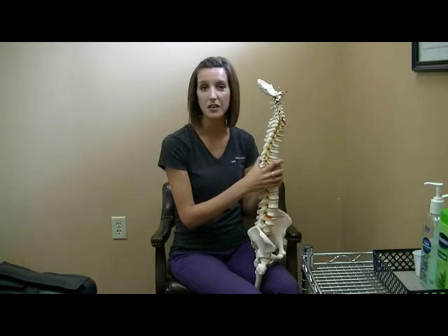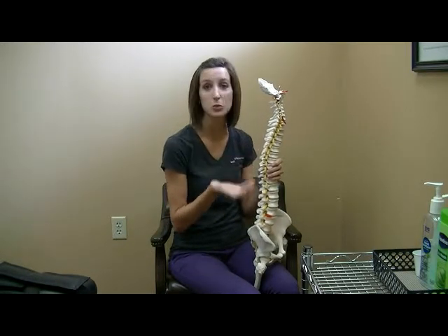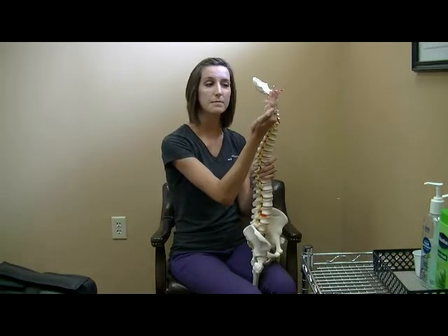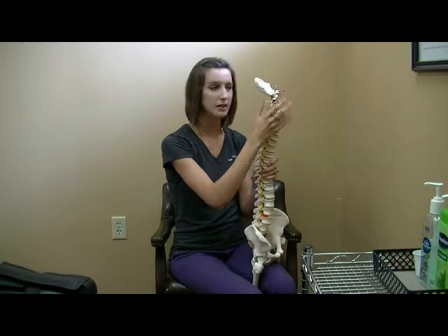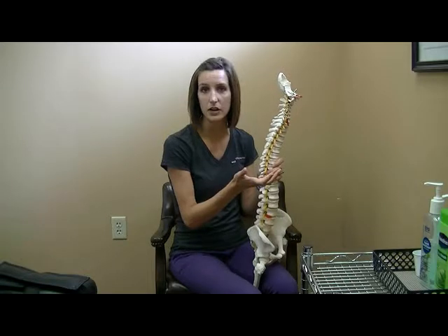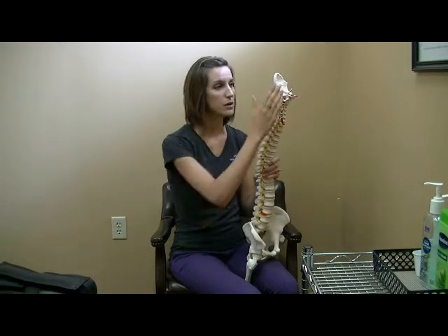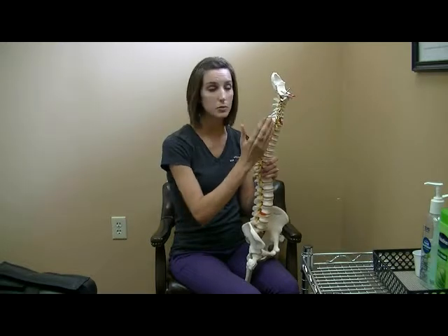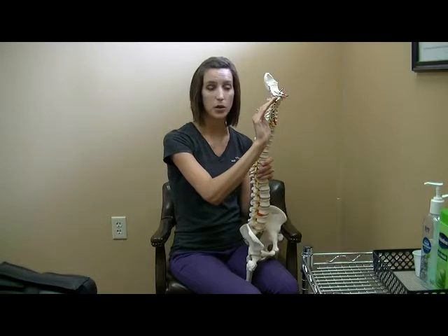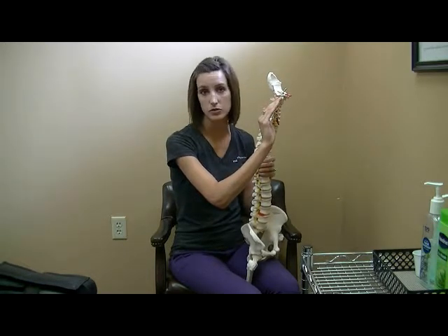Day to day, a lot of people tend to sit with shoulders forward and head forward, especially computer workers. Tend to sit with kind of that slouched posture, so over time they lose that curvature in their neck. When you lose that curve in your neck, it really changes the mechanics of the area. And so that's going to turn into symptoms or some sort of findings down the road. So we can see on an x-ray usually for people if they have lost that curve in the neck, or if it's gotten so bad to the point where it's actually curving the opposite direction of normal. That's called a reversed lordosis.